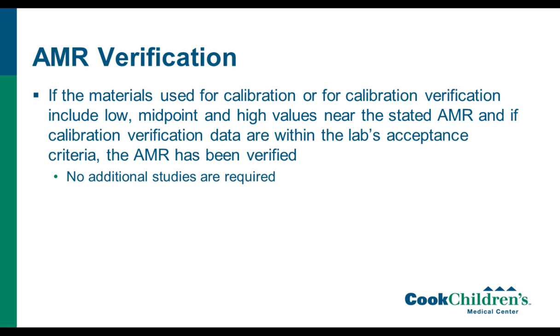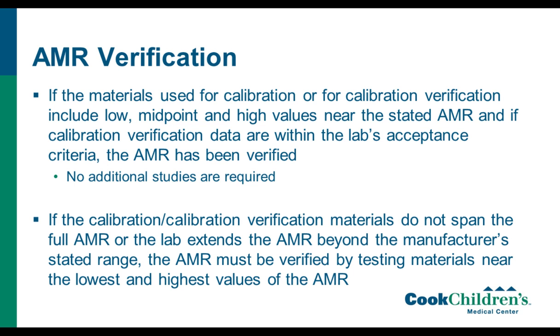AMR verification may actually not be required depending on how you're running your specific test. So if when you run your calibration verification, you're using low, midpoint, and high values near the stated AMR, so near the high and low, and if your calibration verification meets your acceptance criteria, then you actually don't have to perform a second verification. You don't have to do a specific AMR verification. That's already been met by your successful calibration verification.